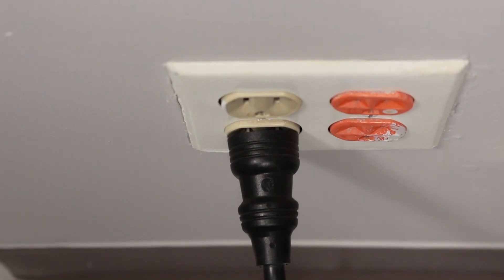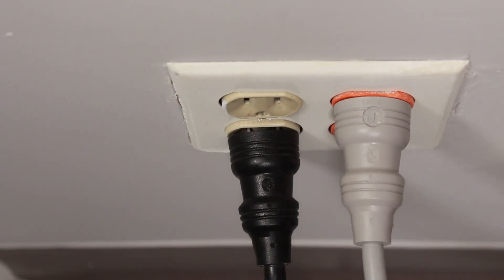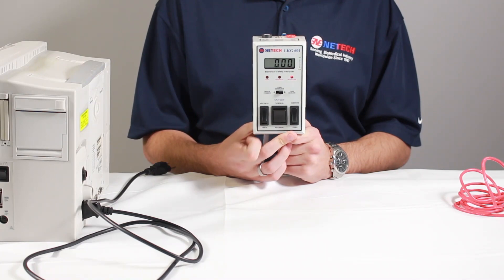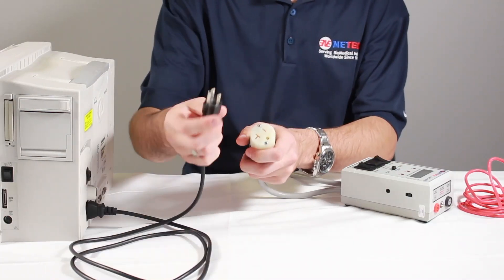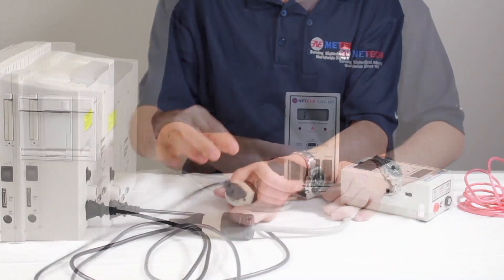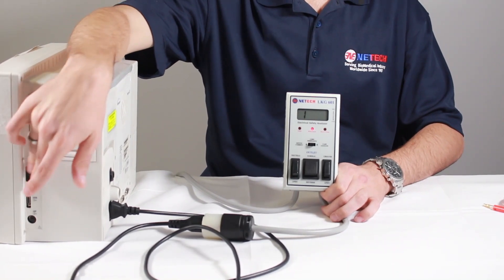Now let's perform a simple safety test using the LKG601. Plug the inlet into the wall to power the unit. Set the polarity switch to the OFF, center position. Then connect the power cable of the device under test to the test receptacle. Set the polarity switch to NORMAL, and power on the device under test.